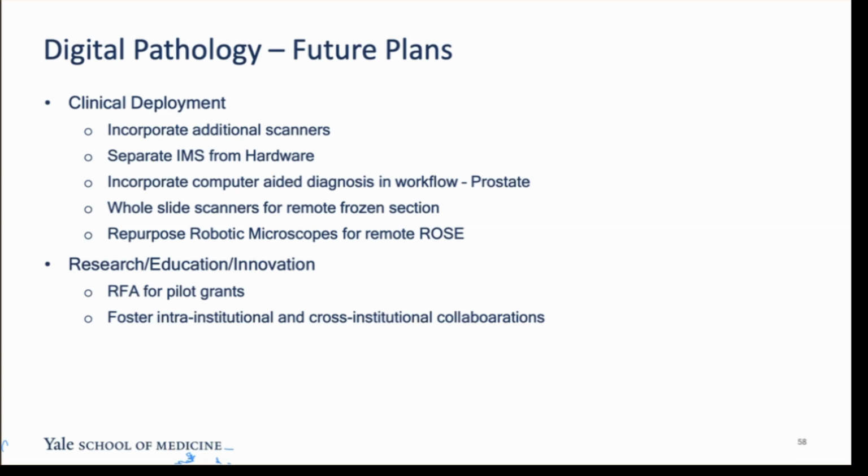For example, we are at some point going to transition to Epic Beaker, and there are already image management systems in existence right now that interface with Beaker, so the need for custom-built software will be less. I think we'll head more to an area where it's off-the-shelf products being brought together with some bridging.